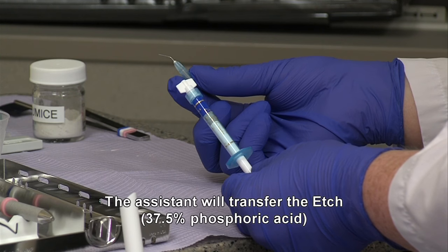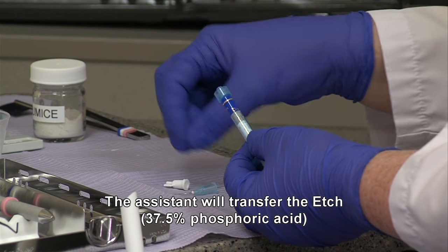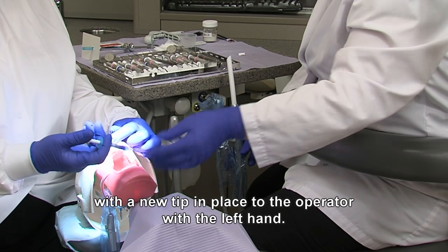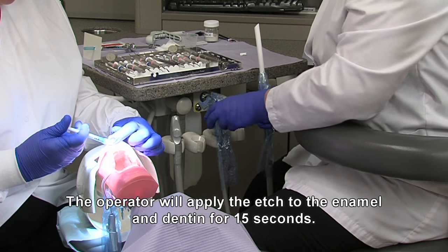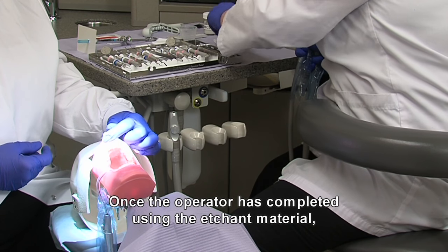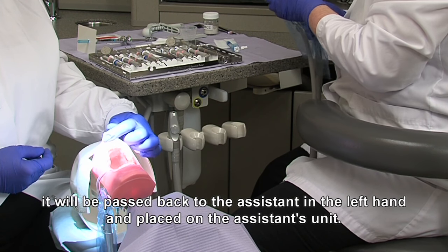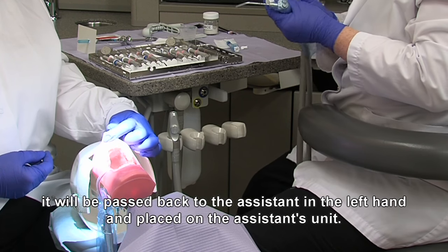The assistant will transfer the etch, 37.5% phosphoric acid, with a new tip in place to the operator with the left hand. The operator will apply the etch to the enamel and dentin for 15 seconds. Once the operator has completed using the etchant material, it will be passed back to the assistant in the left hand and placed on the assistant's unit.